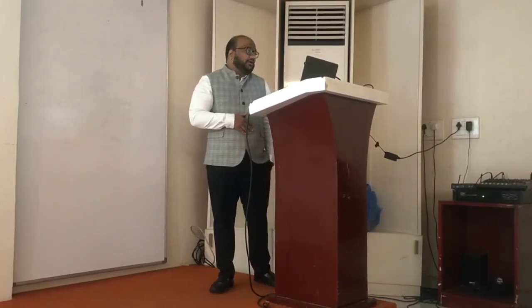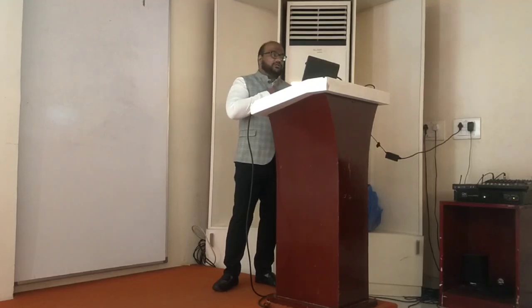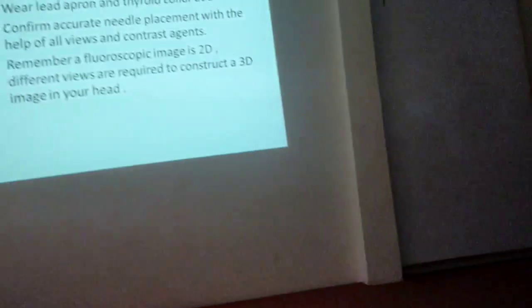Shielding, of course: lead aprons help to decrease the exposure to physicians' organs by more than 90%. Thyroid shields will protect your gland from radiation, which can cause cancers. And recently, eyewear has also come. Protective lead eyewear can reduce the incidence of radiation-induced cataracts. So my take-home message is please wear lead aprons and thyroid collars at all times.